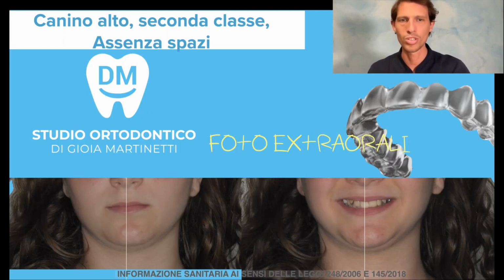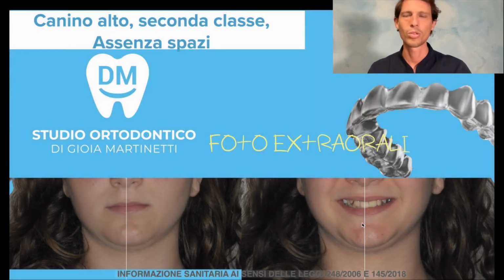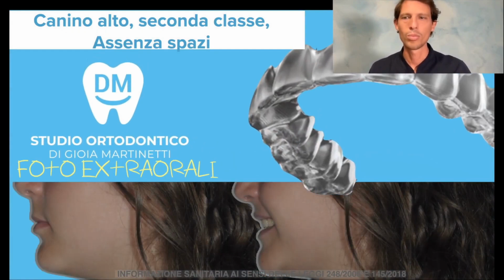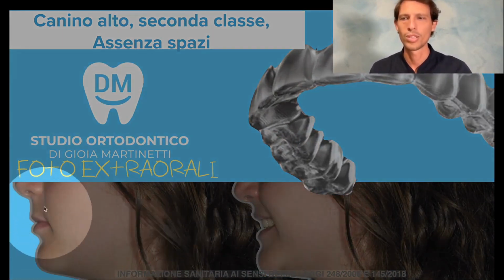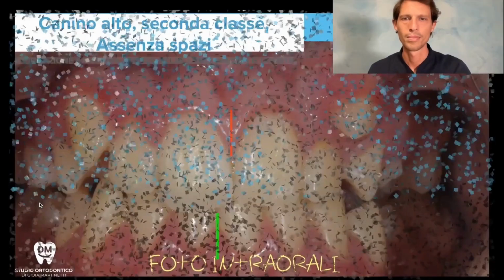So the initial situation had the center of the mouth shifted entirely to the left compared to the face. A slight asymmetry of the chin, but who doesn't have that? And in terms of profile, a good profile, meaning the lower part, the chin and the area below the nose are practically at the same level.